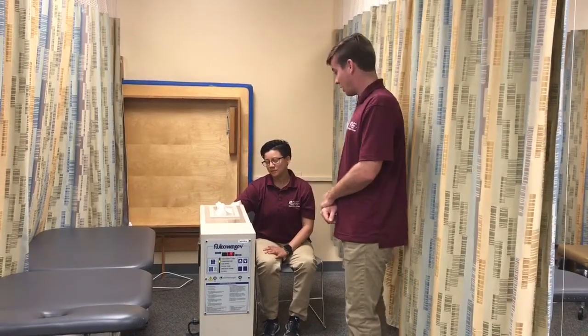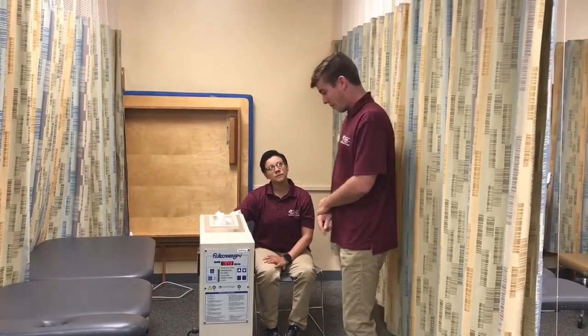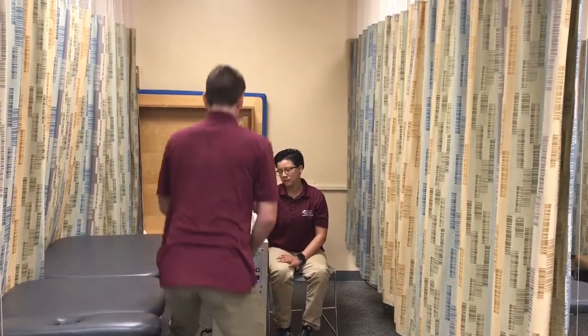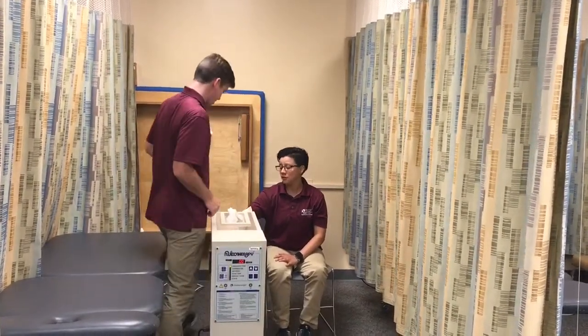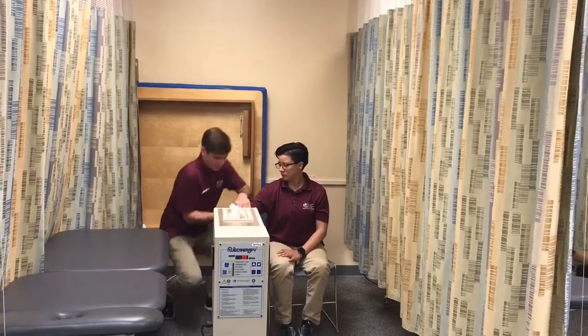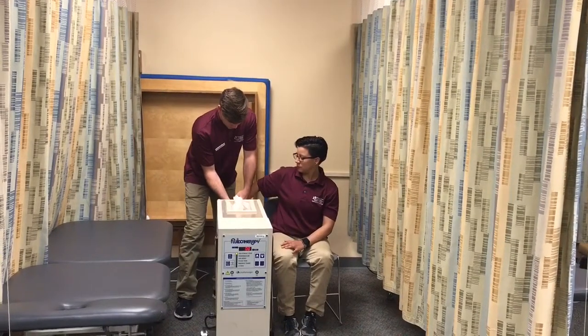Alright, it's been 20 minutes and the treatment time is done. I'm going to turn the machine off. How are you feeling? Feels good. Now I'm going to take your hand out and scrape all these particles off — it's going to get a bit messy.